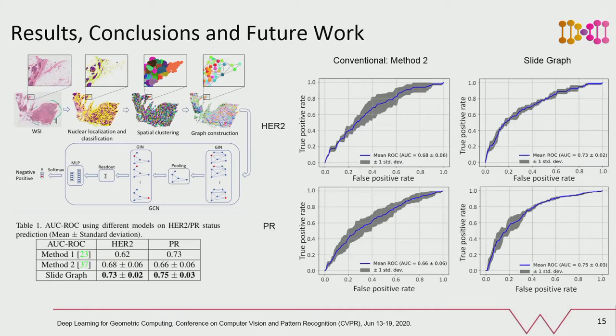To conclude, we have developed a method for capturing cellular topology in whole slide images which can be applied to other problems in this and related domains.